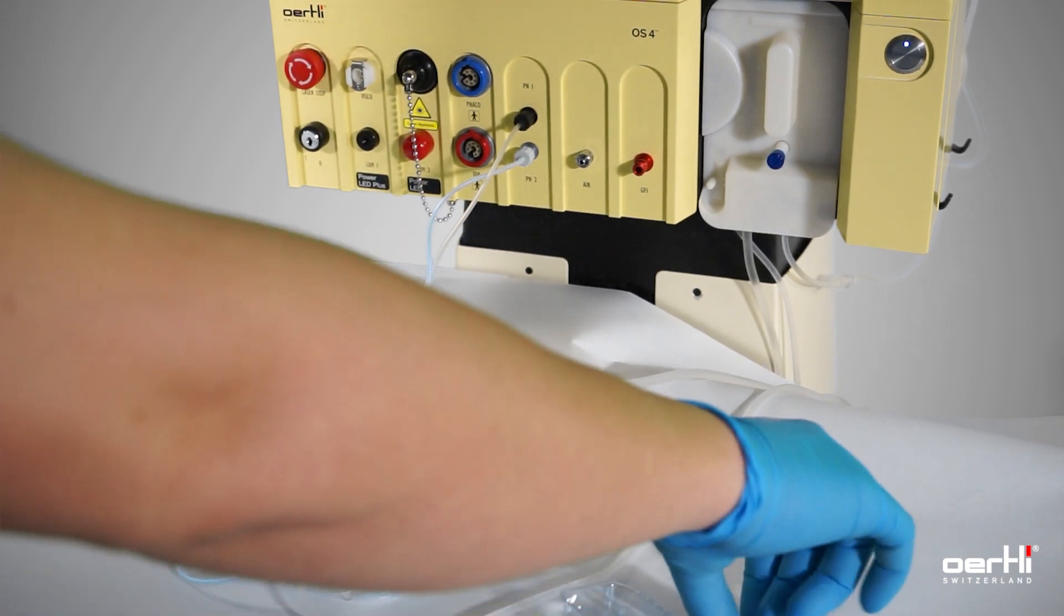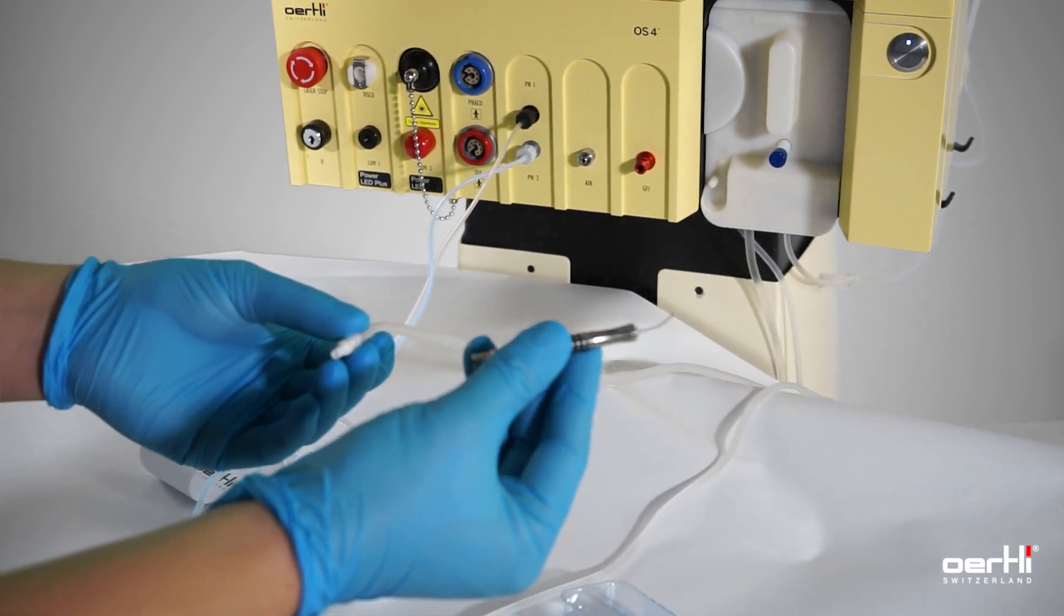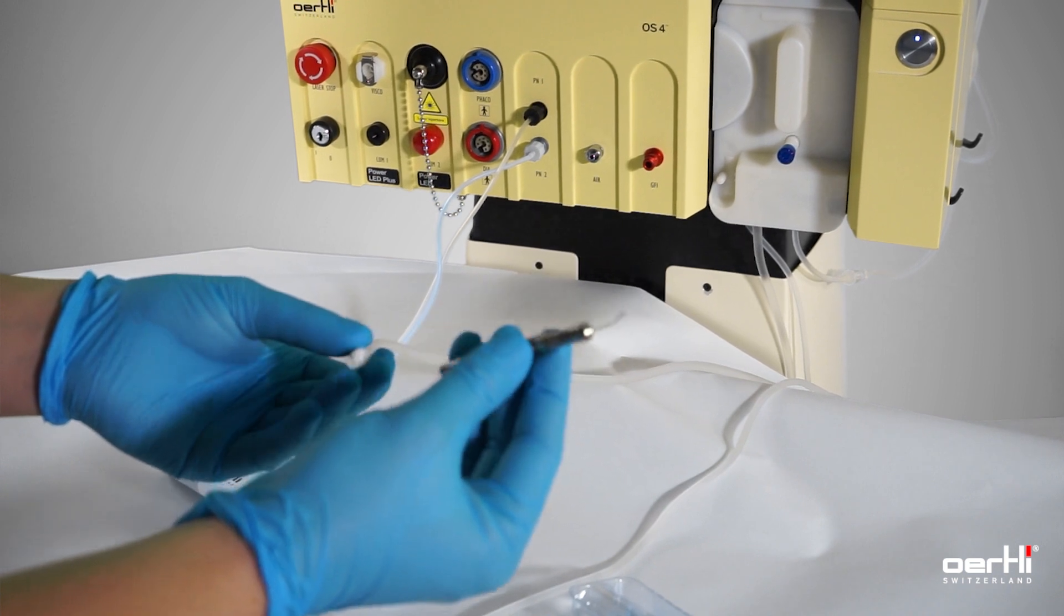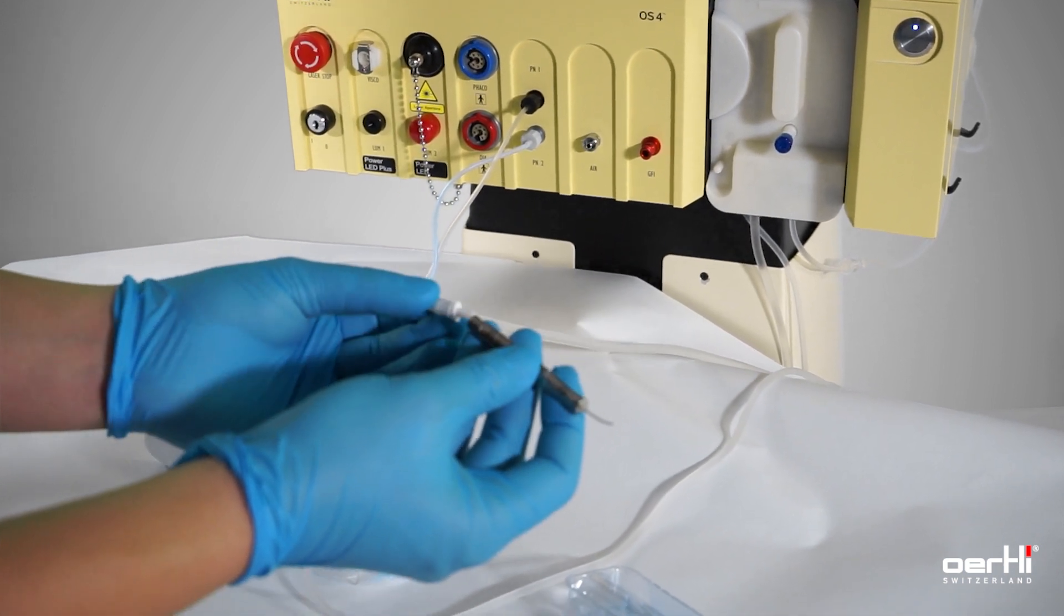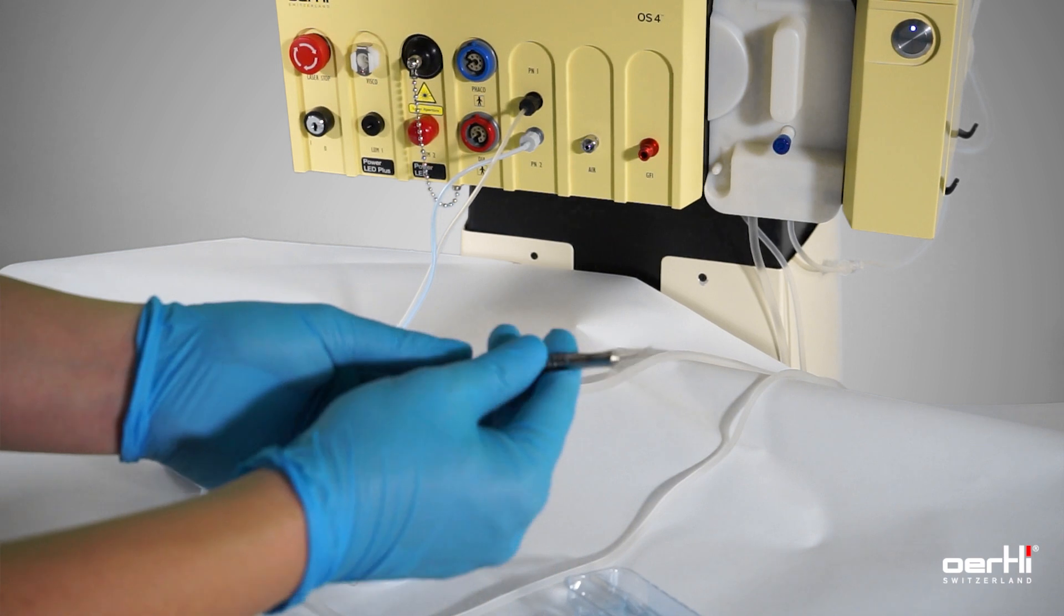The irrigation line goes straight into the irrigation bimanual IA handpiece, either single use or the reusable one.